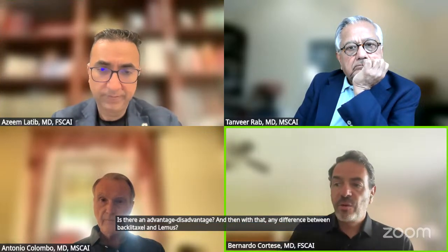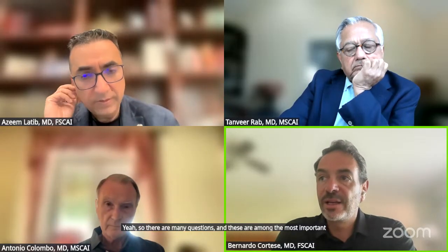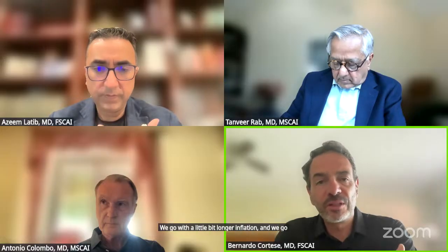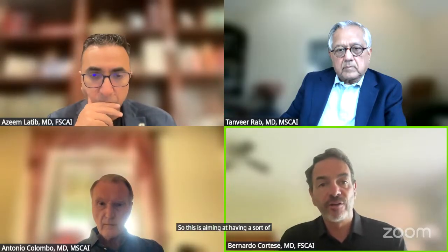Yeah, so there are many questions, and these are among the most important topics. I would say that what we usually do is, during the pre-dilatation, we go with a little bit longer inflation, and more recently with repeated inflations. So this is aiming at having a sort of preconditioning for the myocardium, allowing a longer inflation of the DCB.